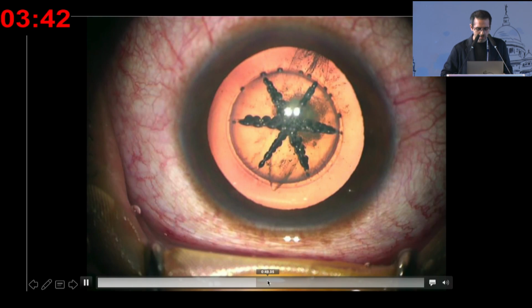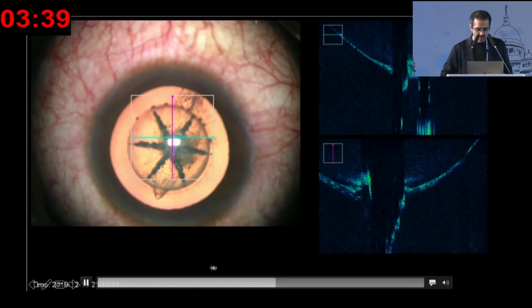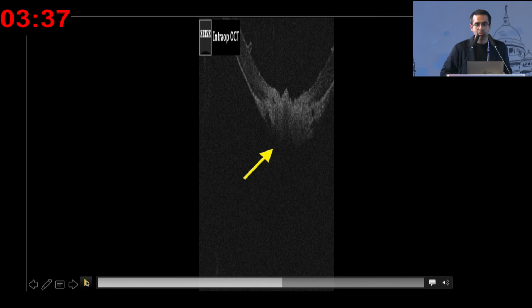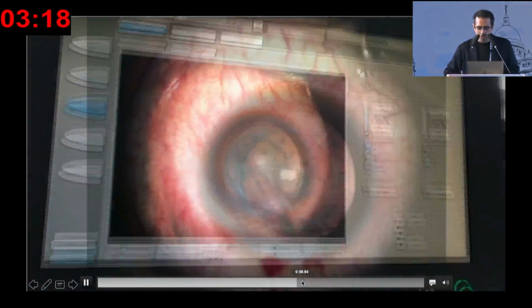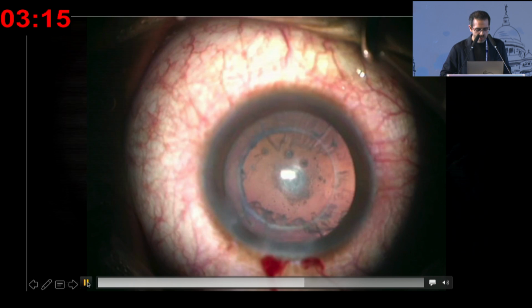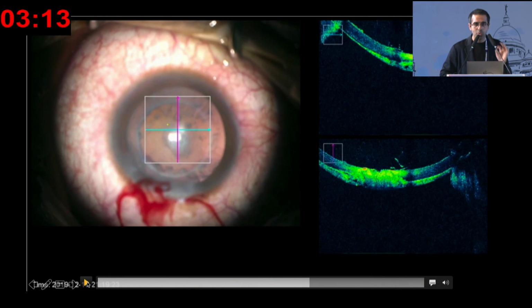Once the patient is on the table, if you see this image on the right, this is the microscope integrated ASOCT. It shows us that, of course, there is a discontinuity in the posterior capsule, but with the offset, we have a thick epinuclear cushion here. So all the turbulence is going to happen in this area, and our posterior capsule is pretty safe. So we can go ahead and do our phacoemulsification as routine, keeping in mind all the points for a posterior polar cataract.